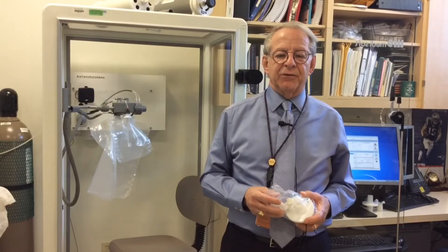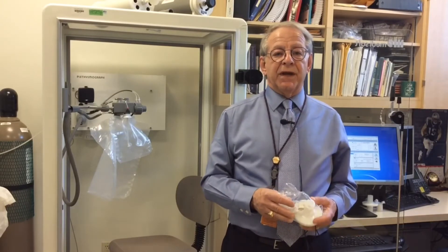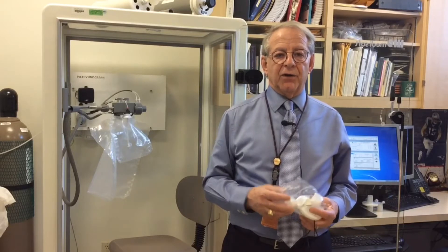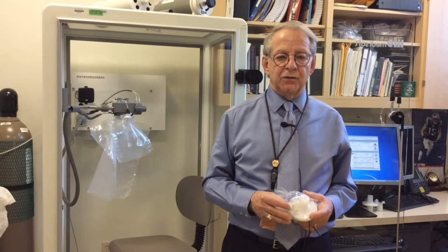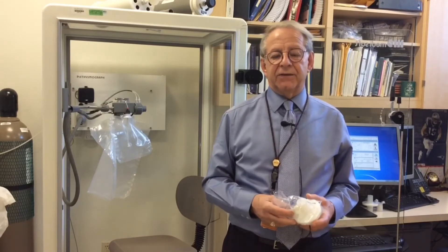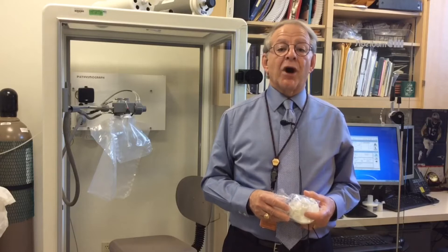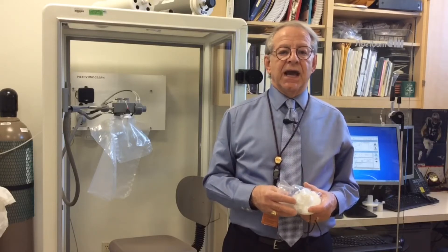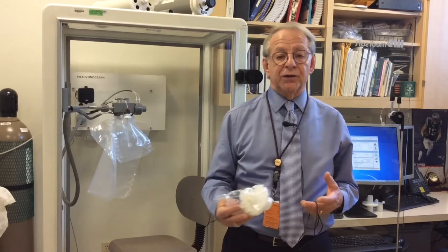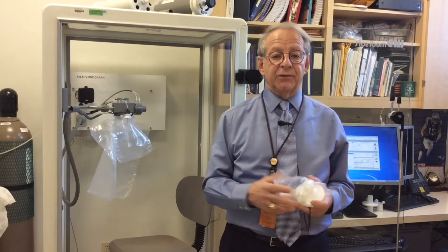We're going to demo with Danielle now. When children come into the laboratory, sometimes they're intimidated by everything they see. So we try to make it more welcoming and take our time coaching them in exactly what we want them to do. For younger children, I'll say things like: if you can blow out your birthday candles at your birthday party, you can do this test. That usually puts them at ease.